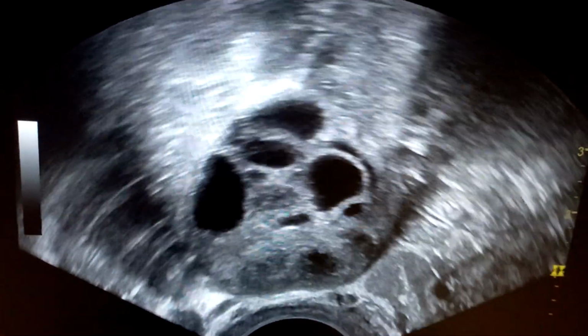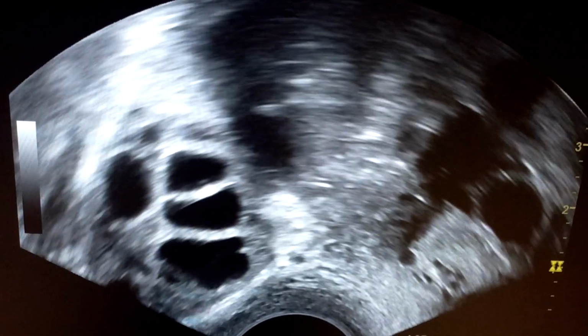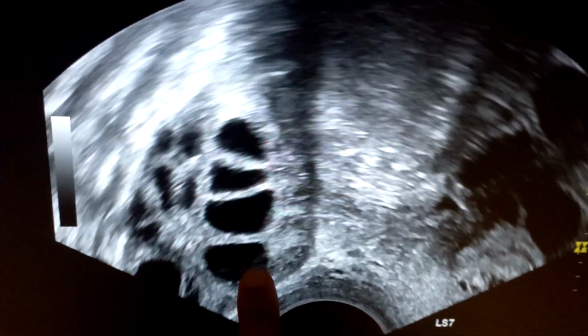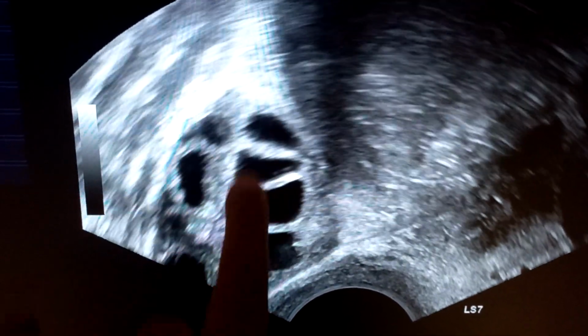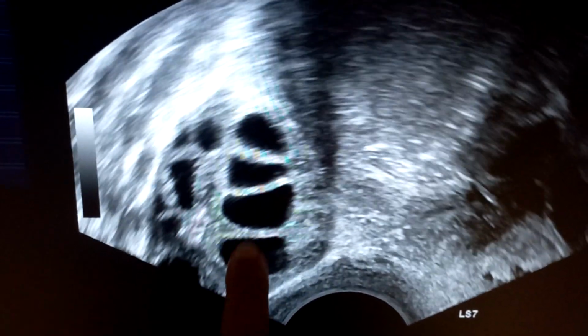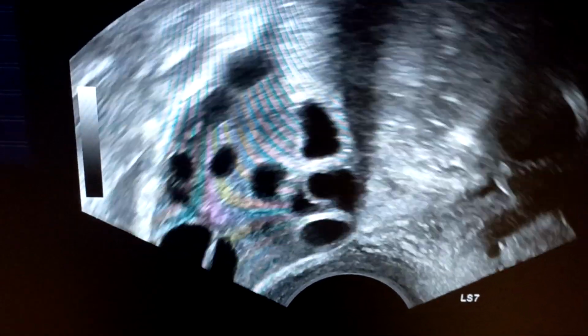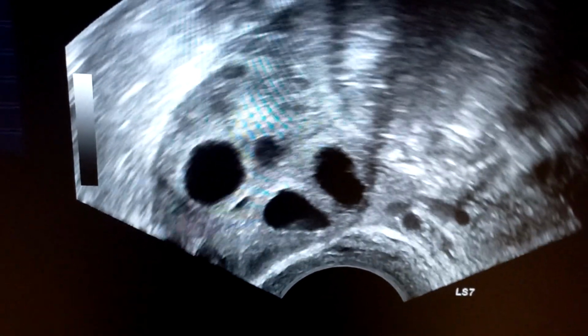This is a high LH polycystic ovary case. You can make out so many follicles are there in a line. You can see over here. So when we are aspirating this ovary, we'll be directly putting a needle, aspirating all of them out in a sequence. I'll show you this when we are doing the case in any further video.